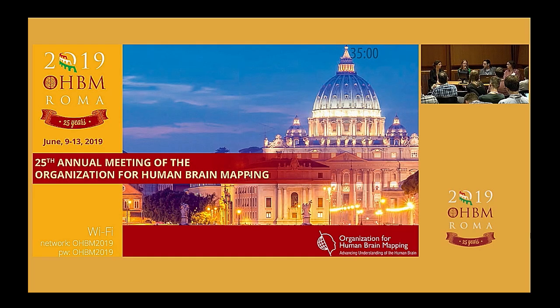And that's a real shame because, first of all, if you don't see it at the time, there's nothing you can do about it if it's ruined data. But second of all, if you look at it at the time after the first scan and you see that there's been a problem, you can again coach the participant, make sure that they understand that they can't do what Alex was showing earlier, having a little look around and all the rest of it, and that's going to be a problem. So it's a lot about the education between both the operator and the participant who might not be familiar with the environment. And there can be a lot of variability on that too, in fact.